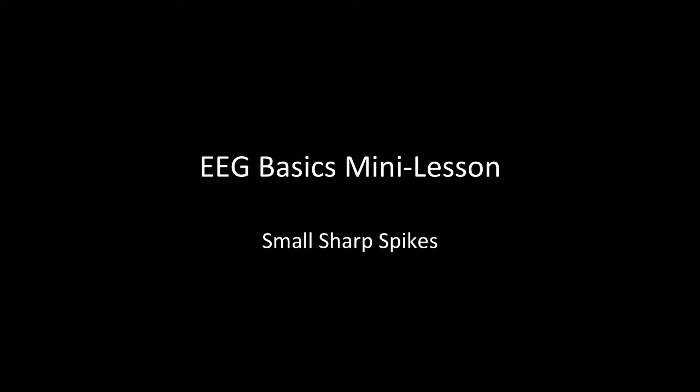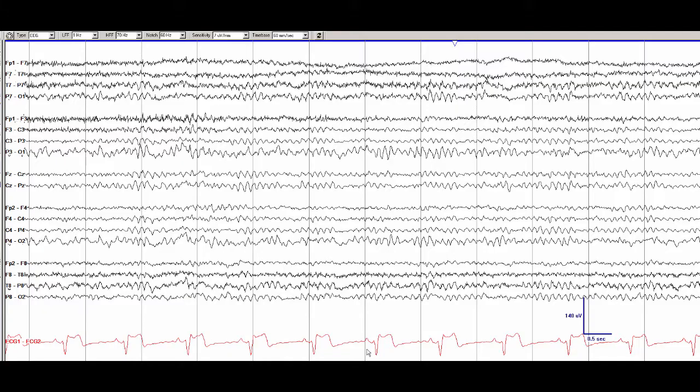This is an EEG Basics mini lesson focusing on small sharp spikes. Let's review the EEG of this patient who has been admitted for spells of uncertain significance.